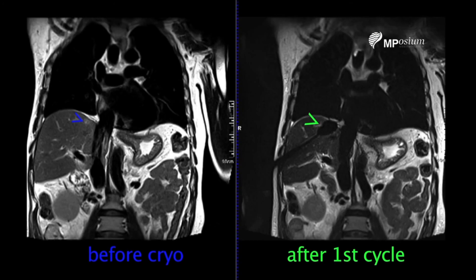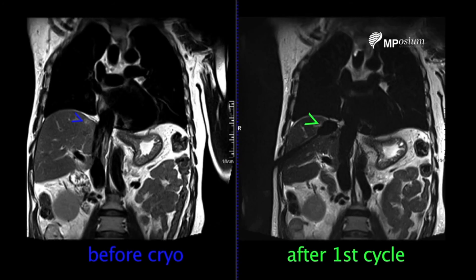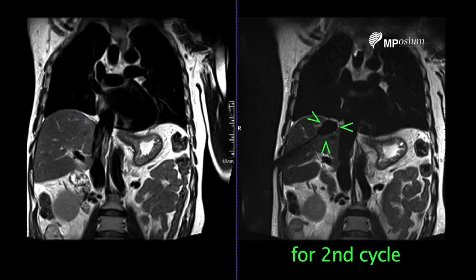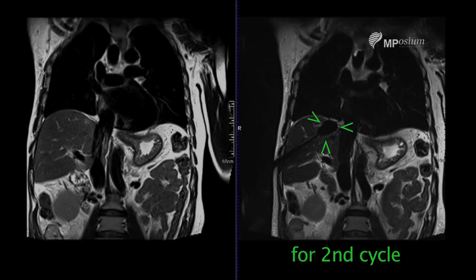We are satisfied with the coverage of the lesion, and with the second cycle we will maximize the damage on the periphery of the ice ball. It appears to be a complete ablation.